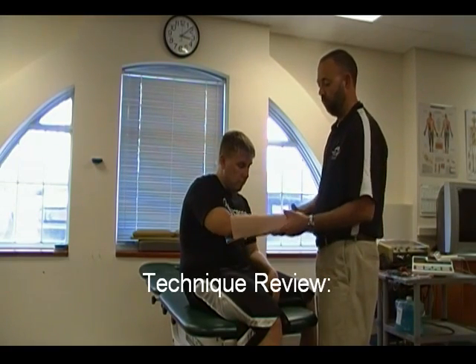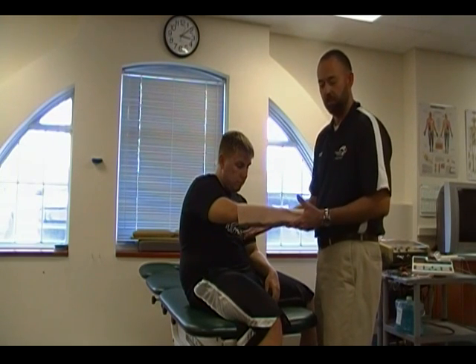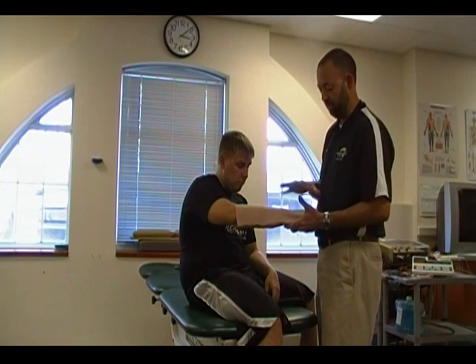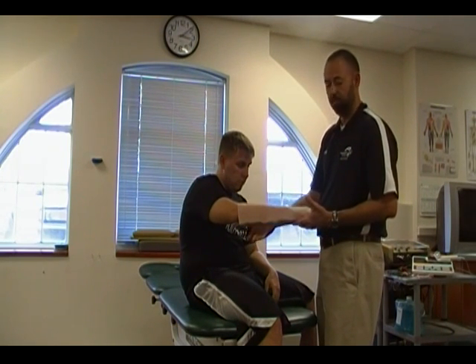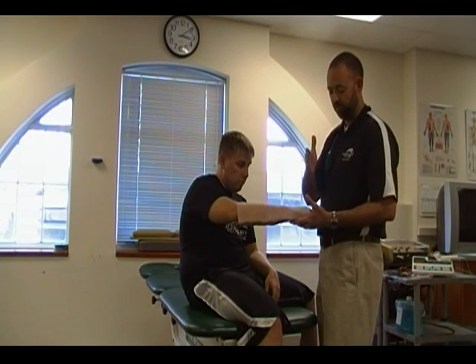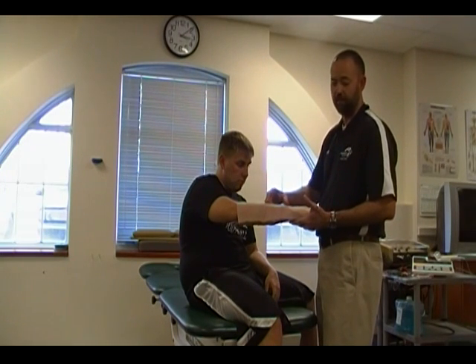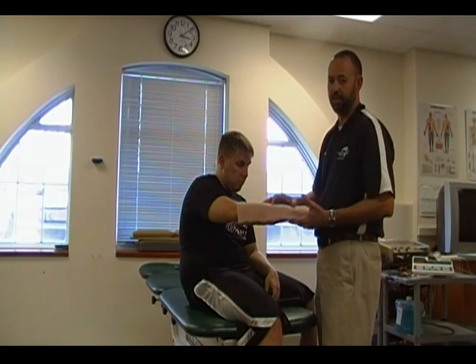To review: you want to use a rigid splinting device — it could be a SAM splint, it could be a rigid board splint, it could be a magazine. You're always going to check for circulation ahead of time. You're going to support the extremity and then apply your elastic wrap from distal to proximal, overlapping and gently applying compression, if at all, over the area of fracture.